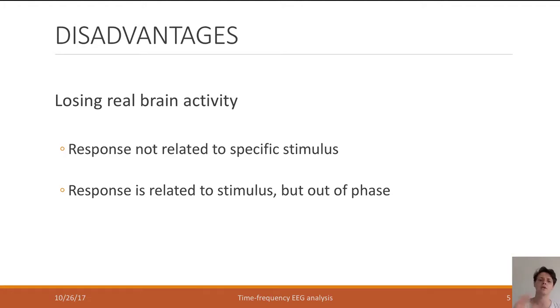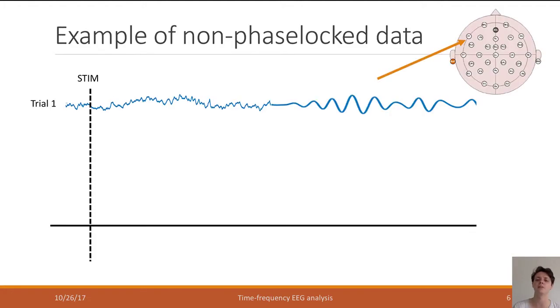And I want to give you an example of this, and this is a very crude example. This is an example that I just created. This is not an example that you will find in the brain, but let's imagine that we're doing a working memory task, okay? So let's imagine, just try to keep as many numbers in your head as possible. 5 numbers, 7 numbers, it doesn't necessarily matter. And this is the trial data, this is the EEG data.